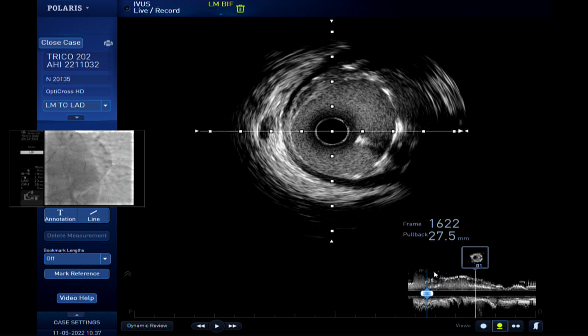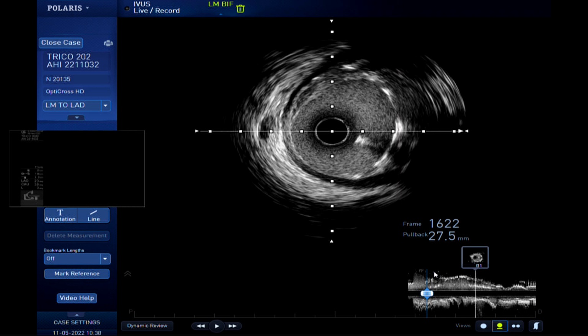So Dr. Akasaka, I think the question from the moderator was whether you could just do a focal stent of the ostial LAD based on IVUS. That was the question. Yes, I'm sorry. If I can show the IVUS, it might be very easy to explain, right? Here is, no, you cannot see the IVUS, right? The disease continues to the just proximal, right?